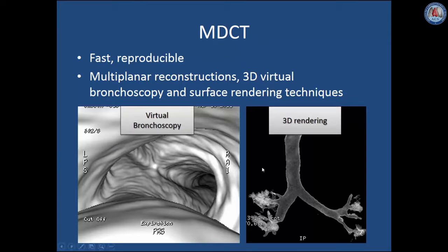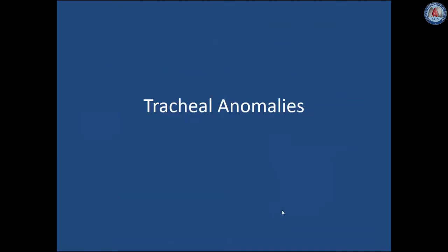On the left is a virtual bronchoscopic image of the carina from the bronchoscopist's perspective, showing the right main bronchus and left main bronchus. Notice the invagination of the membranous wall on this expiratory image. On the right is a 3D rendering of the trachea and bronchi.